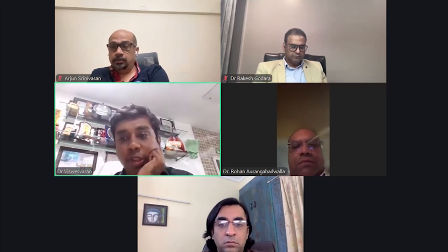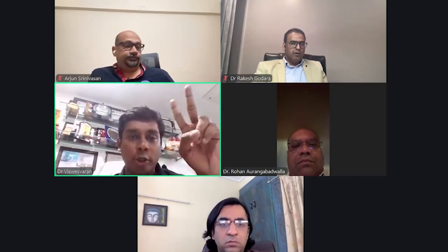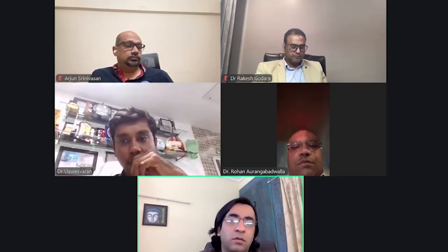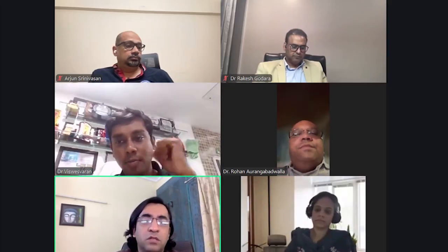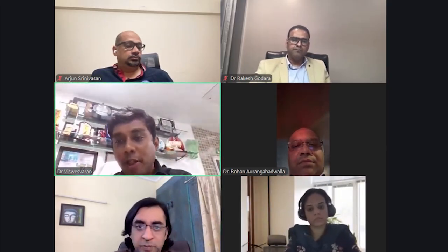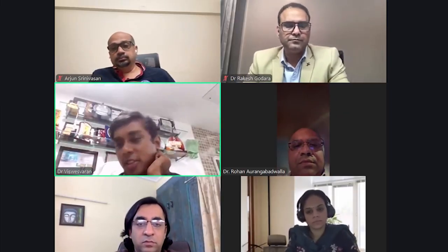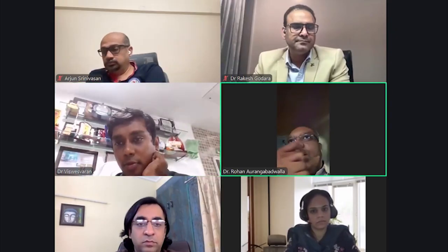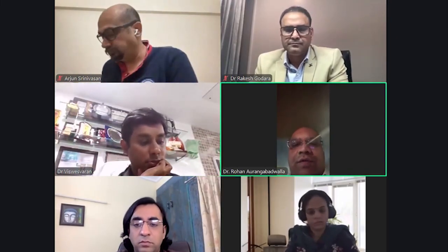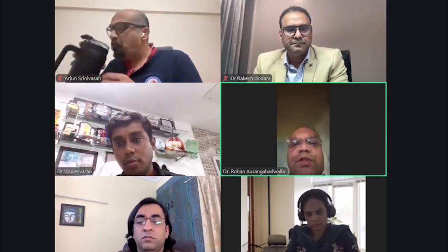And now we move to Dr. Saurav. This is a question from Dr. Uday from Bombay: what is APC and how does it differ from electrocautery? Two quick points. APC is a non-contact modality and electrocautery is a contact modality. APC is usually for superficial lesions, and when you want deeper ablation, you use electrocautery. And Dr. Gaurav from Indore asks Dr. Rohan: what is electrocautery snaring? Just briefly, it's used for pedunculated lesions so that you can completely take the lesion off. It goes around the lesion and cuts it along with coagulation. So that's how it works.